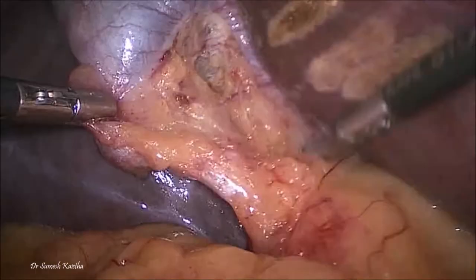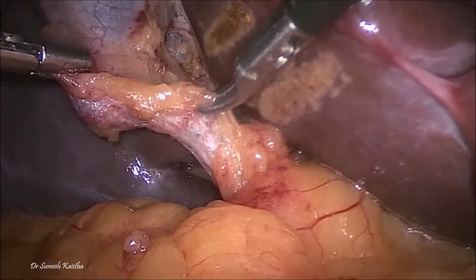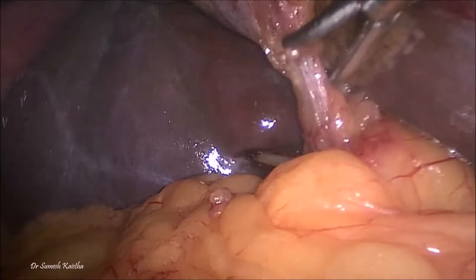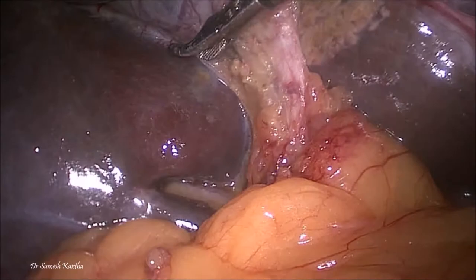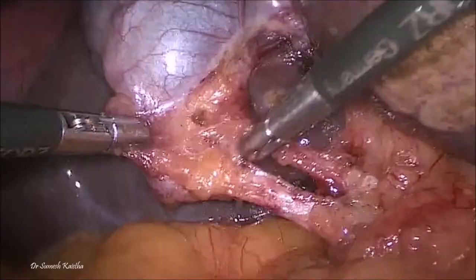That's the CBD, and it is not necessary to divide the cystic duct down to the junction of the CBD. By pushing the infundibulum medially, the peritoneum is further stripped off the gallbladder and cystic duct. It's very important to remain above the Rouvière's sulcus, which lies in the same plane as the CBD. If one remains above Rouvière's sulcus, it's very unlikely that one can damage the CBD.